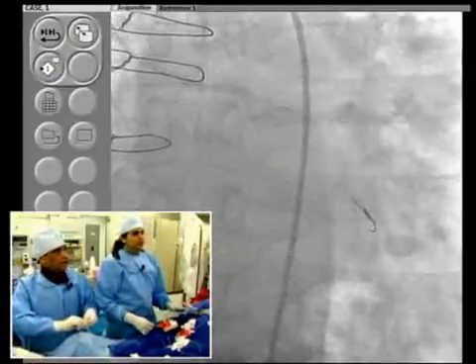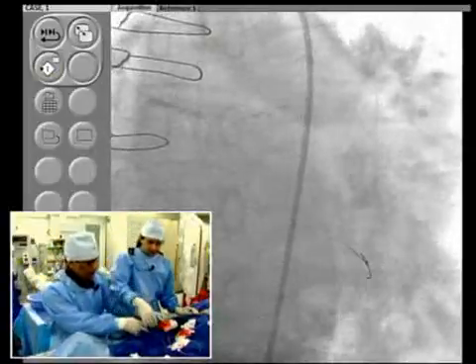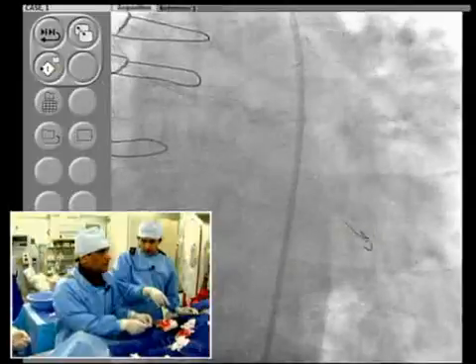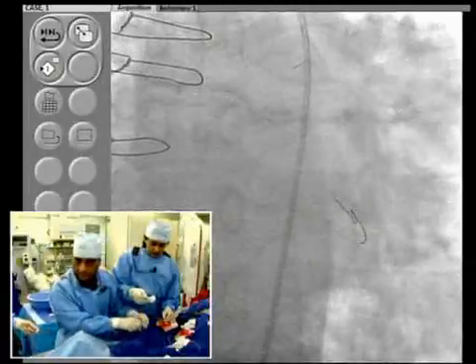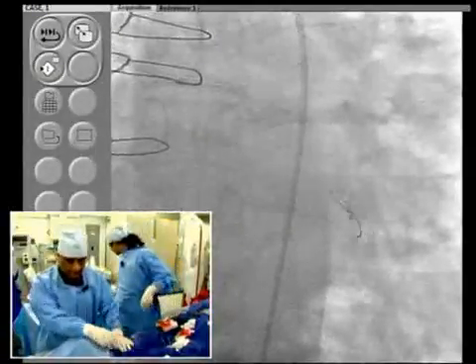What was the size of the Zion stent there? 3.0 by 23. And clearly you want to do proximal post-dilation? Yeah, proximal. We have to dilate with a 3.5 by 20 Voyager for the left main. For the left main, right. Cut it or no?